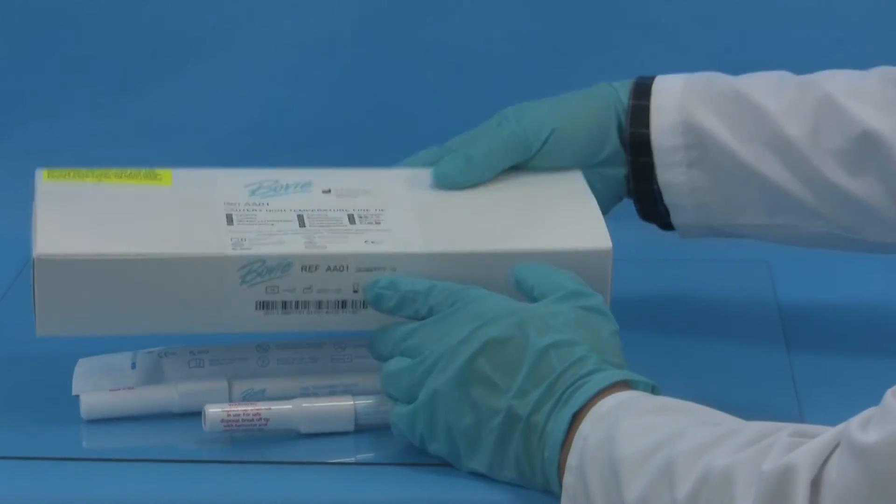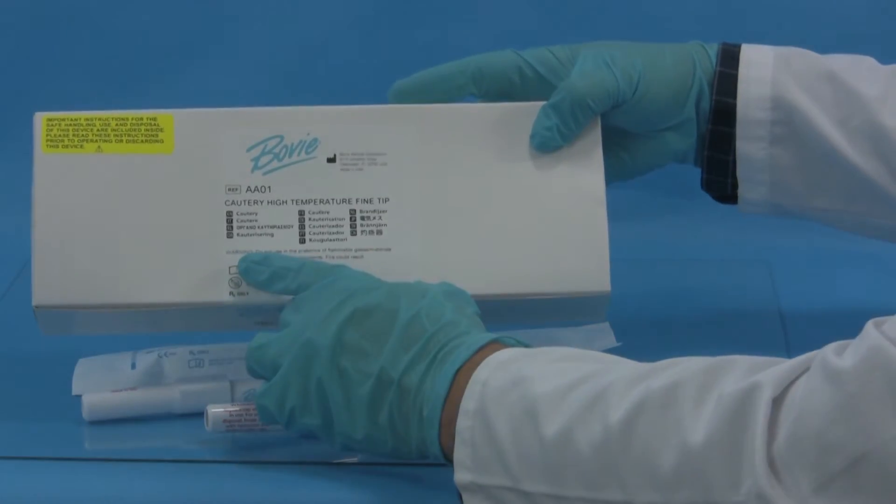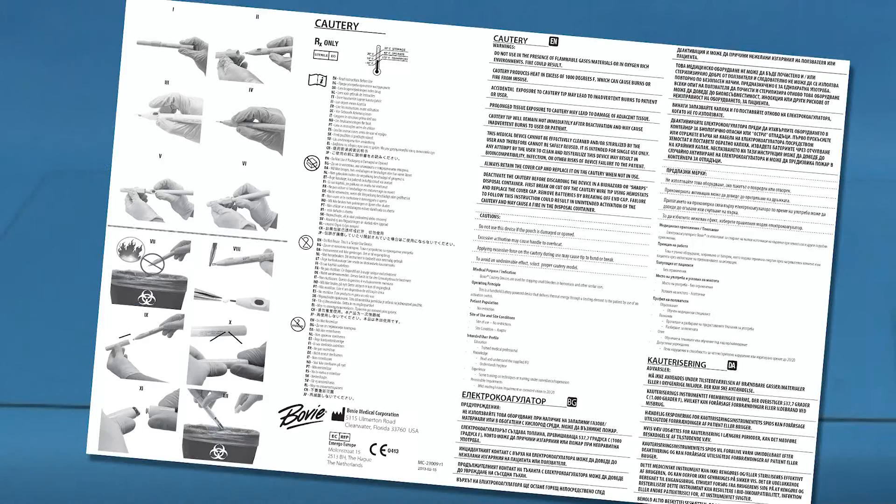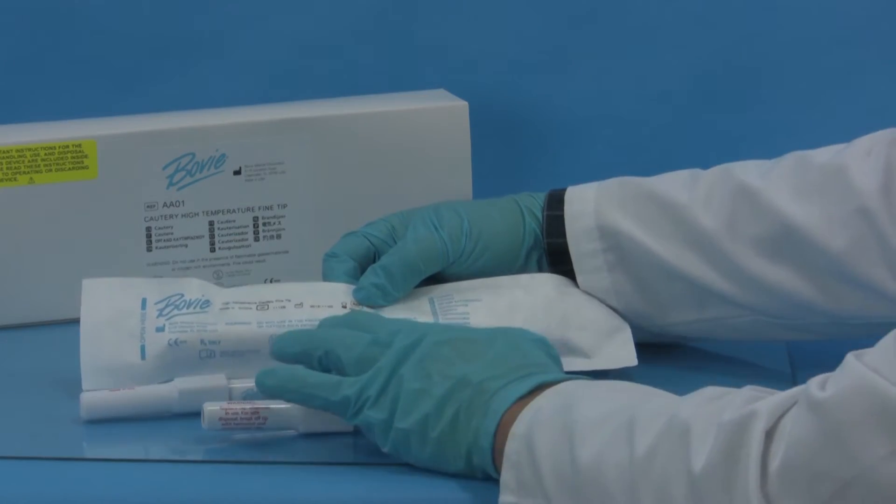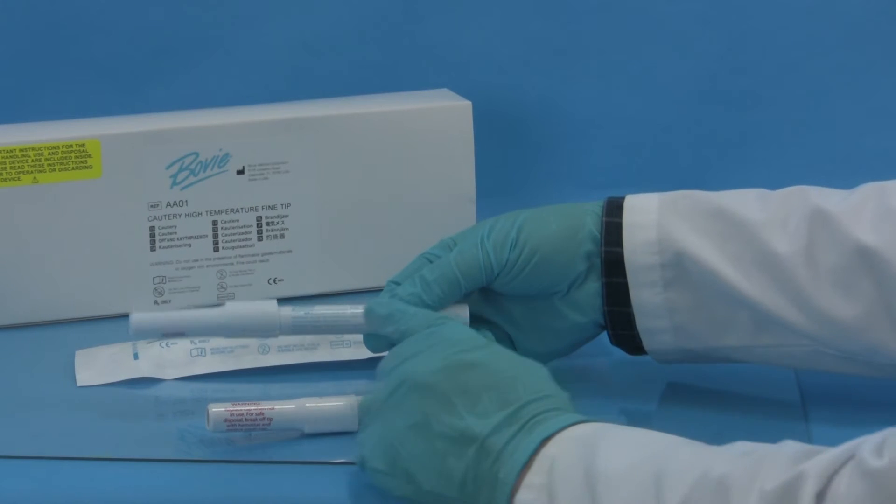For your convenience, cautions and warnings are printed on the box label, instructions for use, peel pouch label, and on the cautery handle.